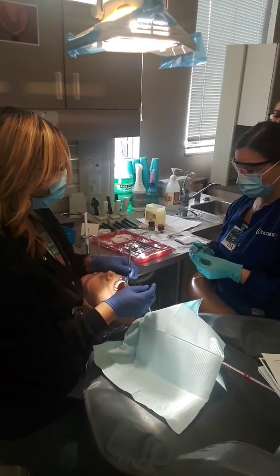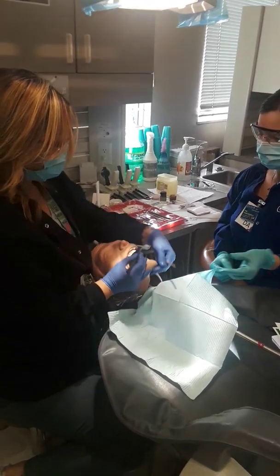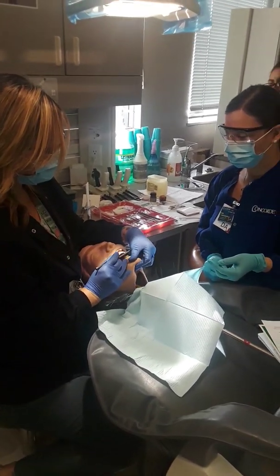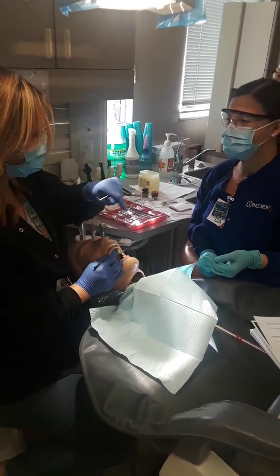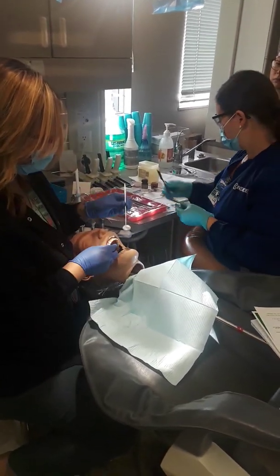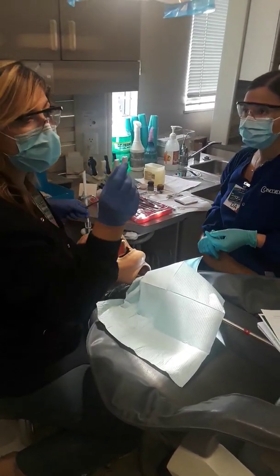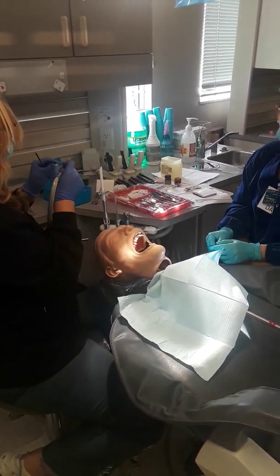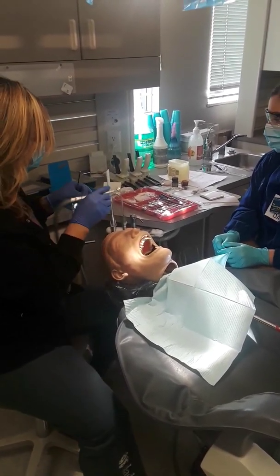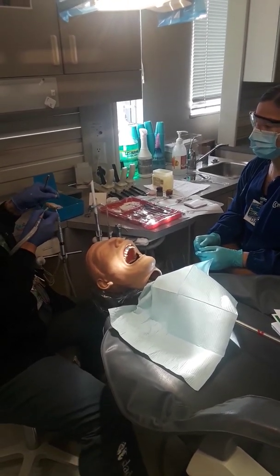Then we want to check our bite. So, how would I pass this? This way? Yep. Patient's going to bite, and then we're tap, tap, tap, grind, grind, grind, and then lower jaw is going to push out. Check our bite. If anything needs to be adjusted, we adjust it since it's temporary and not glued in. So we'll do all of our adjustments for our bite if we need to. There's a little piece here.